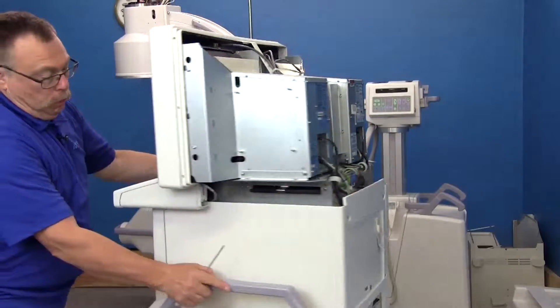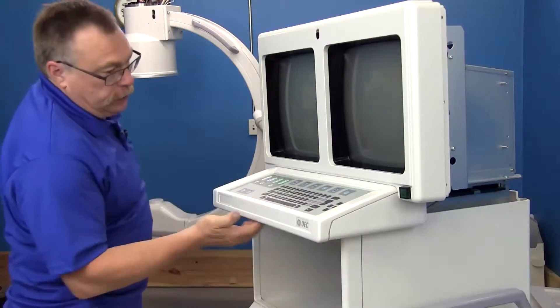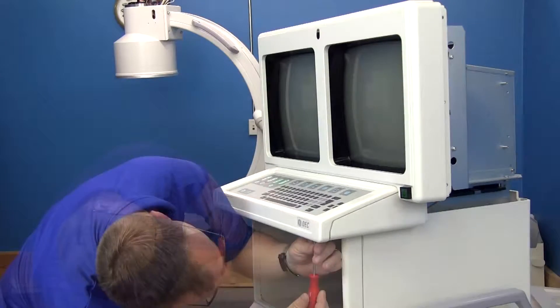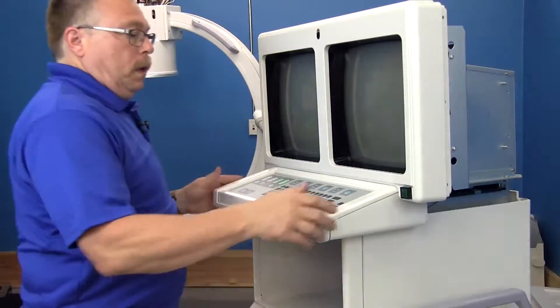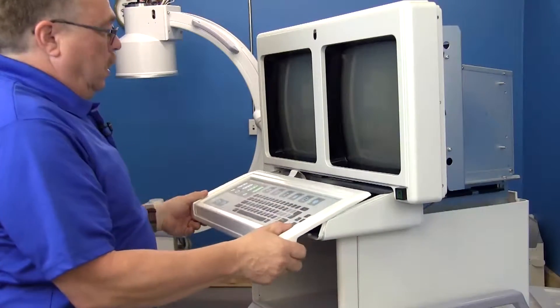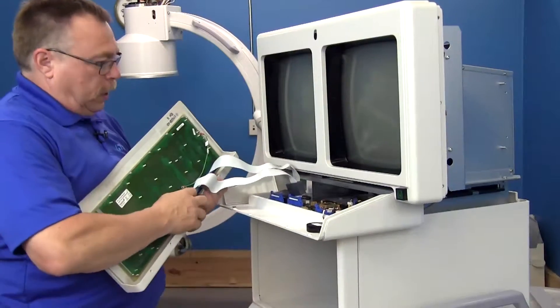Next we want to take the keyboard finisher off, which involves a series of screws underneath — six of them altogether. This is pushed in, so you want to pull it straight off. Then you have the connectors.